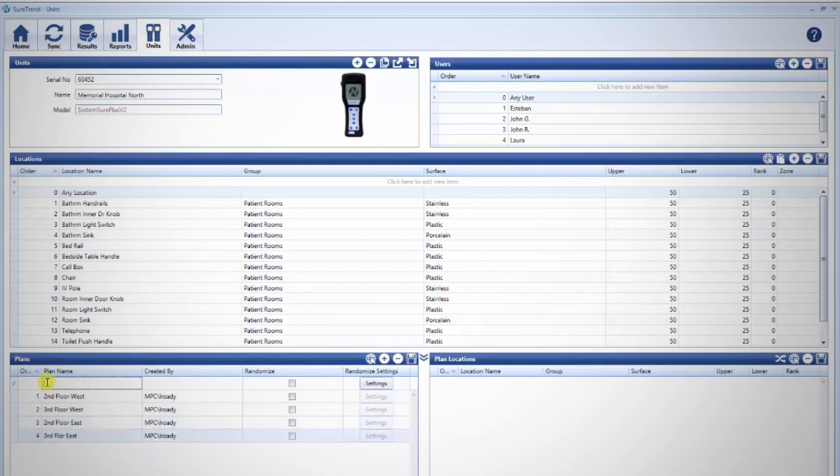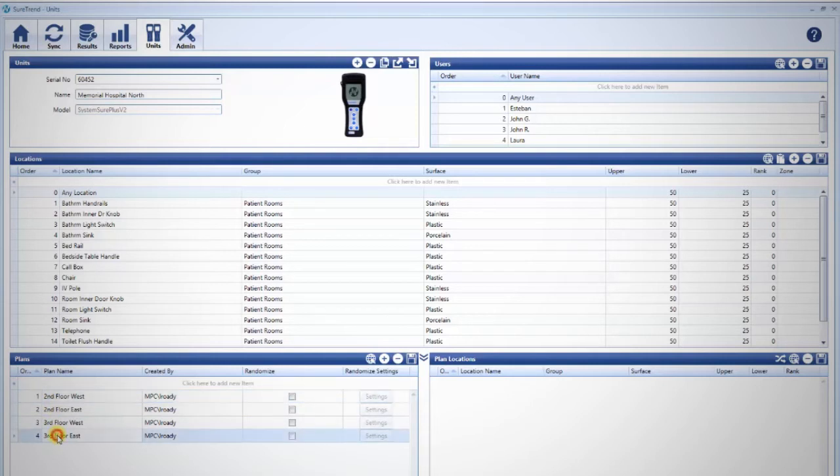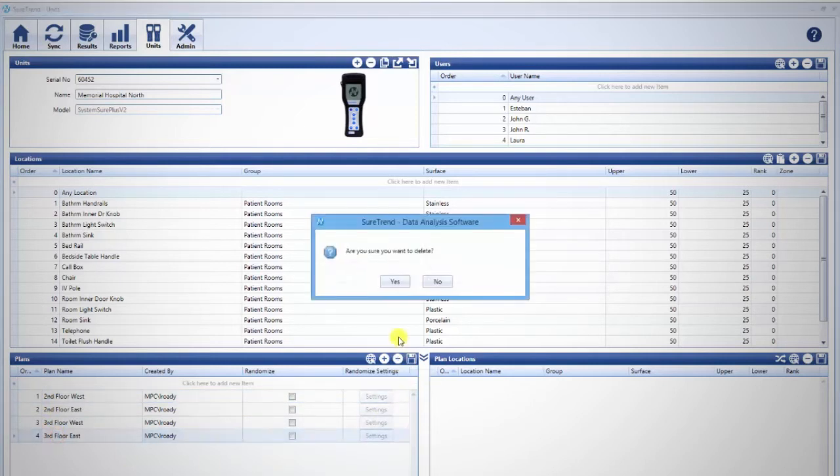Fields can be modified by clicking twice in the Plan Name field. Once all plans are listed, you may rearrange the order in which they will appear on the unit by clicking, holding, and dragging rows to the desired position. To remove a plan, click the minus sign and select Yes.